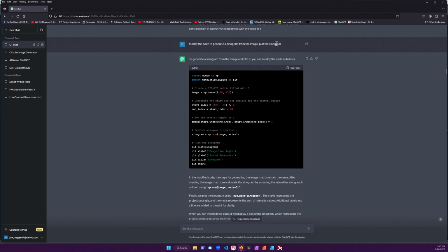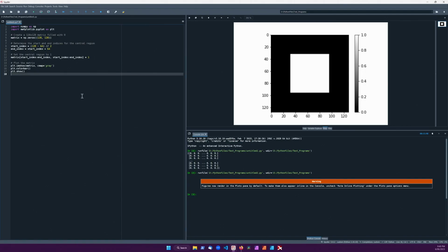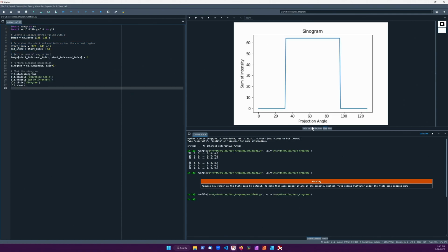plot the sinogram. It immediately generated the code, and I'll copy that code, go back into the Python, replace the code there, and here it gave me a sinogram. Now I know that that's not a proper sinogram. What that is, is plotting a value of the black area up to the white area, down, and that. So I told it that's not correct.